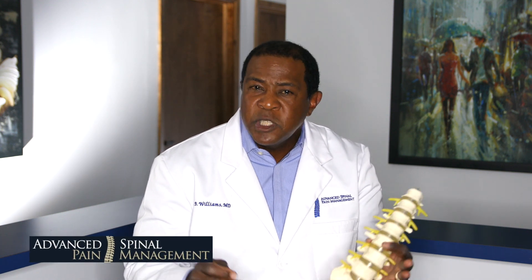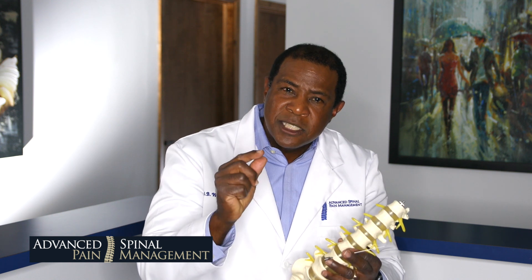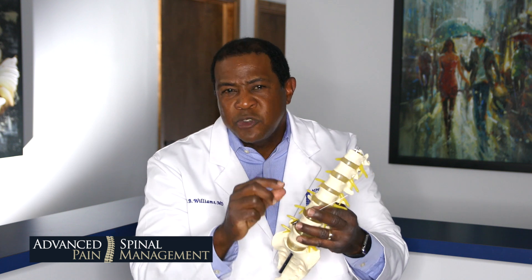When you perform a discogram, you simply put in a needle using local anesthetic and sedation — the patients are comfortable. It's a very small needle, a 22-gauge needle. The length is not important; it's the thickness that matters. A 22-gauge needle is very thin — about four or five strands of hair put together.